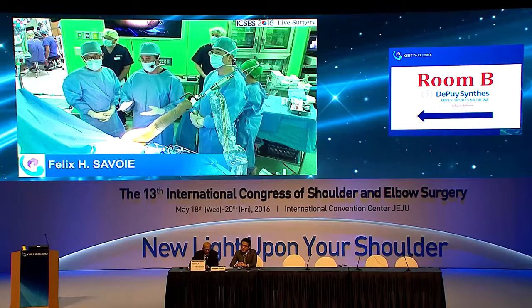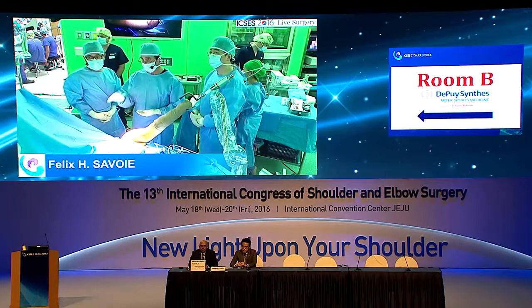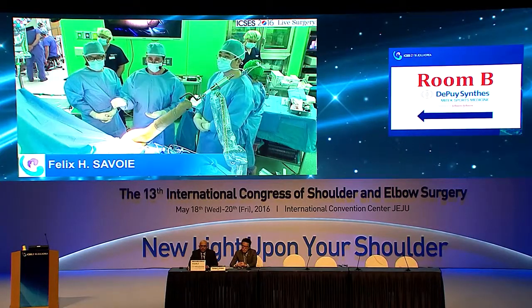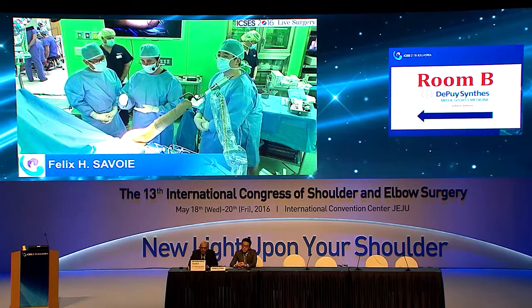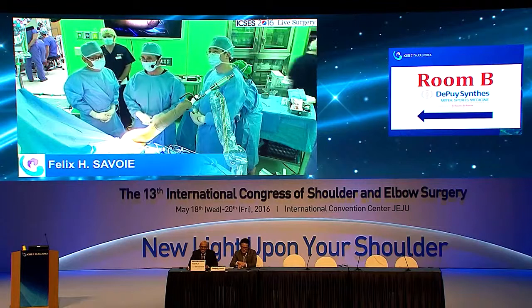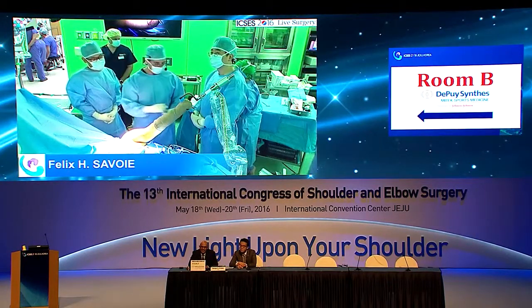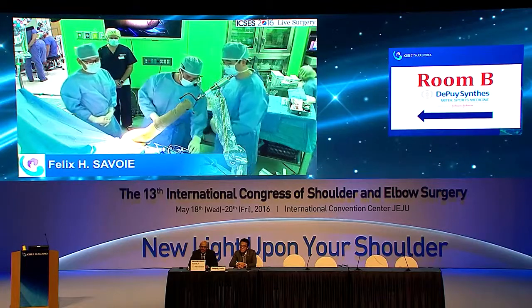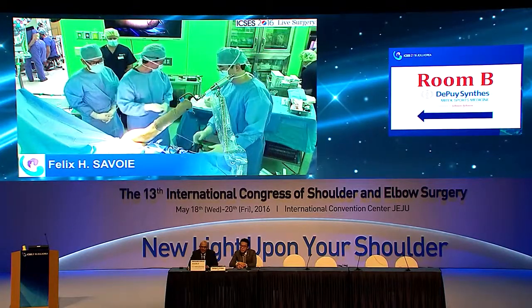So I just repair the cuff where it needs to go. If the superior capsule is still attached to that undersurface part, I should have shown that. I am very sorry about that. But the superior capsule was still attached to the undersurface part. We've got time. You can open it up again, take it all down and fix it again? But the undersurface part, the capsule is going to be back where it's supposed to be because we repaired it.